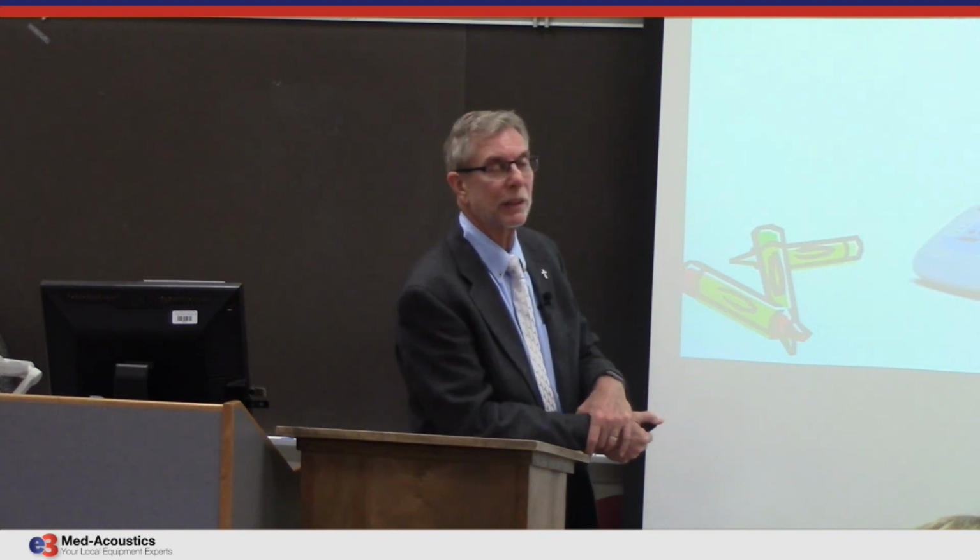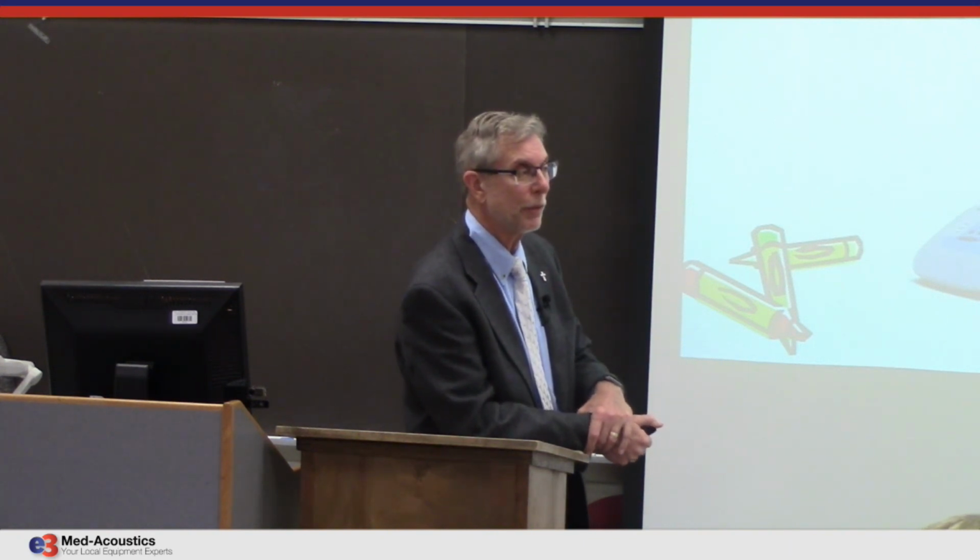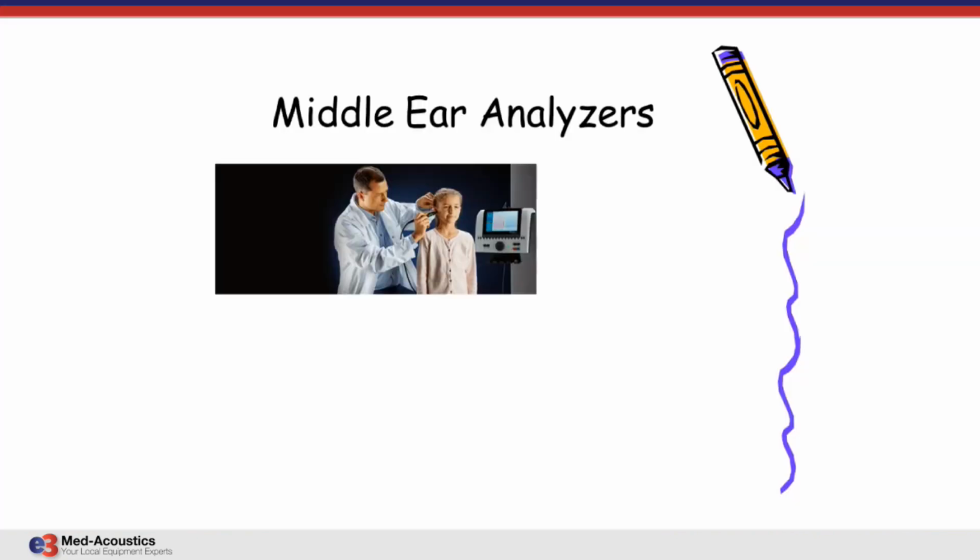You'd have to look at the particular model to see if 1,000 hertz probe tone is available on it or not. With some of these it is available, some it isn't. And if you're doing very young pediatrics, you certainly have to have that. It's a must. Here are some other middle ear analyzers, clinical middle ear analyzers.